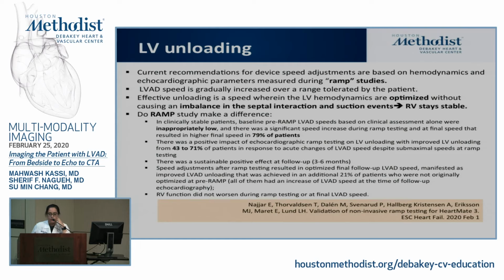So, LV unloading. First of all, I'm going to go over a definition of what LV unloading really means. It's based on your hemodynamics as well as your echocardiographic parameters, and we determine that using ramp studies. In the cath lab, we slowly increase the LVAD speed, as best tolerated by the patient, until we get suction.